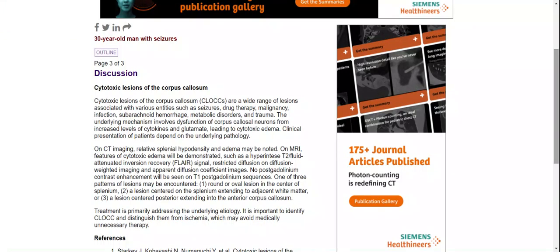Clinical presentation depends on the underlying etiology. On CT, discrete splenial hypo-density and edema may be noted. On MRI, features of cytotoxic edema will be demonstrated, such as hyperintensity on fluid-attenuated inversion recovery signal, restricted diffusion on diffusion-weighted imaging, and low signal on apparent diffusion coefficient maps. No post-gadolinium contrast enhancement will be seen on T1 sequences.